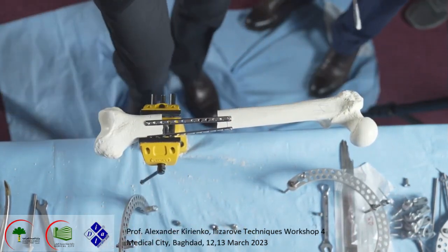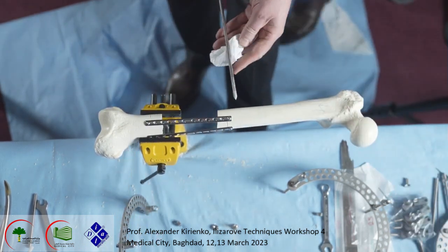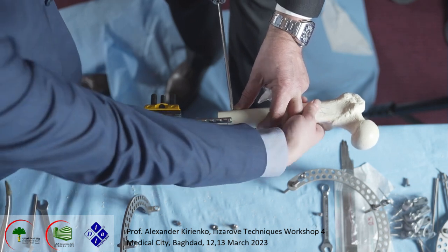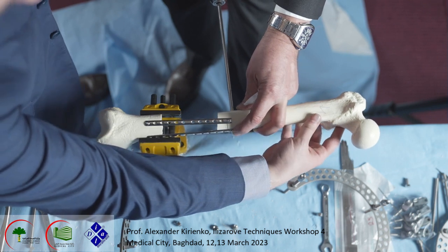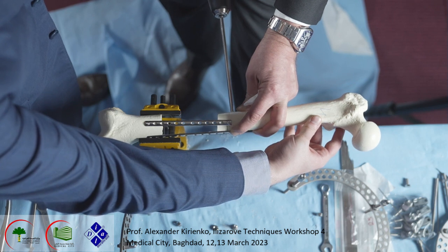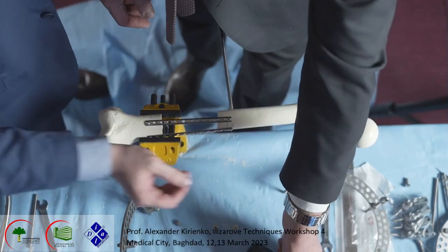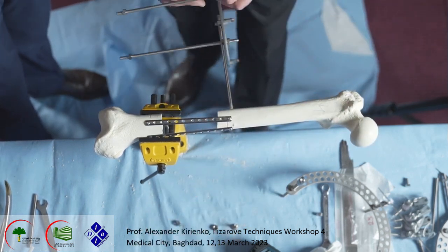What I do, I look at the fluoroscopy, like explained before, and we should put this half pin perpendicular to the diaphysis of the femur, and this way you may be oriented of the position of this fragment. And this half pin, we fix it like this.